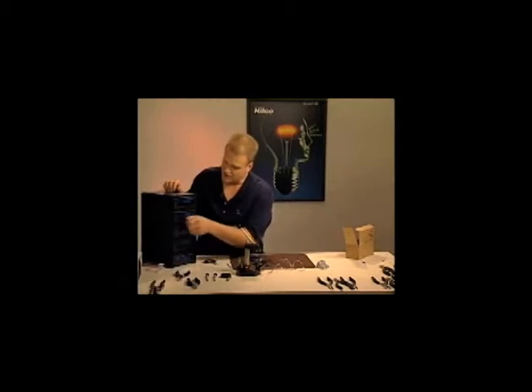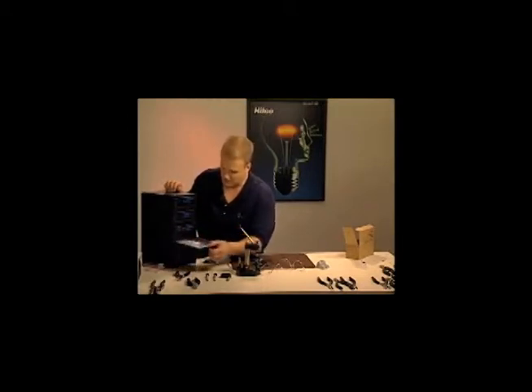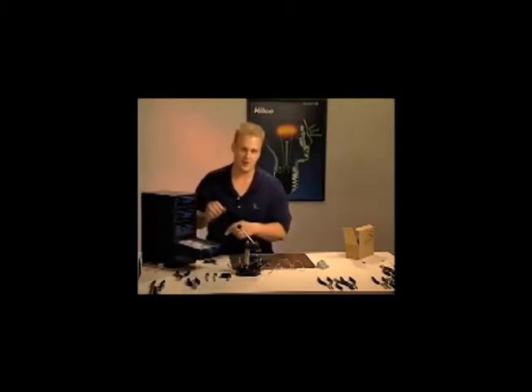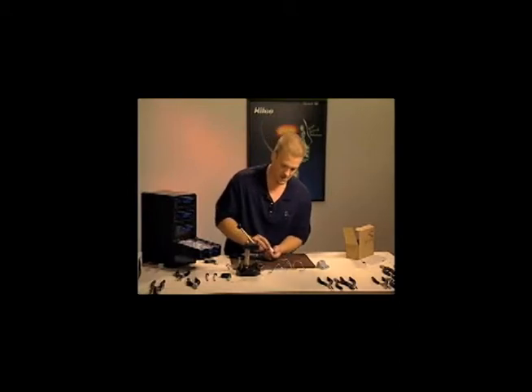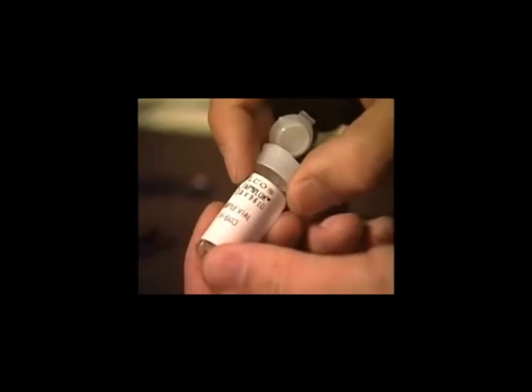Now, you might be thinking, you just punched out a 1.4 and it's stripped. Why are you going to a 1.4 repair screw? That's going to be my starting point. It may or may not work. If this doesn't work, a 1.5 is going to do the trick. And once again, the vials are labeled 1.4.